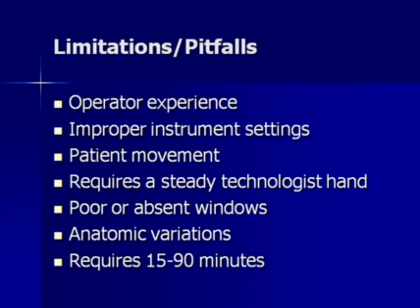Now, of course, any test has some limitations. TCD is extremely operator dependent, such as most ultrasound, but it's pretty tricky. We have to have good equipment. Sometimes we're limited by patient movement. We certainly need a technologist or sonographer with a steady hand. And as I said, in some patients we cannot get proper windows, and it does take a lot of time to get a complete study.